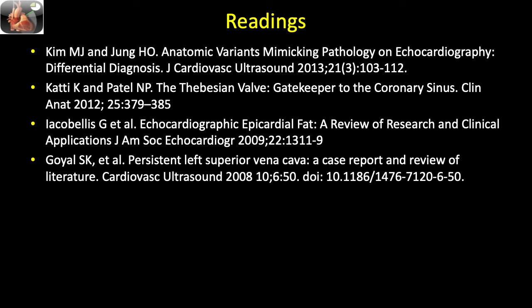As a thick, echo-dense, band-like structure across the right ventricular cavity connecting the lower intraventricular septum and the anterior papillary muscle in the midesophageal four-chamber view. Importantly, it can distinguish the right ventricle and left ventricle and may mimic tumor, thrombus, or vegetation.